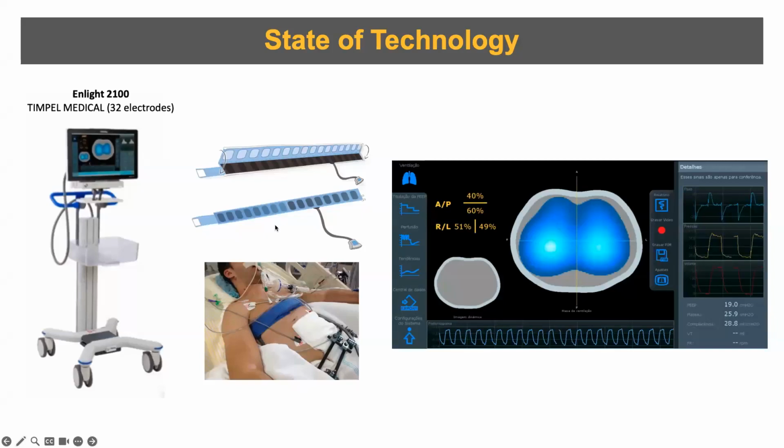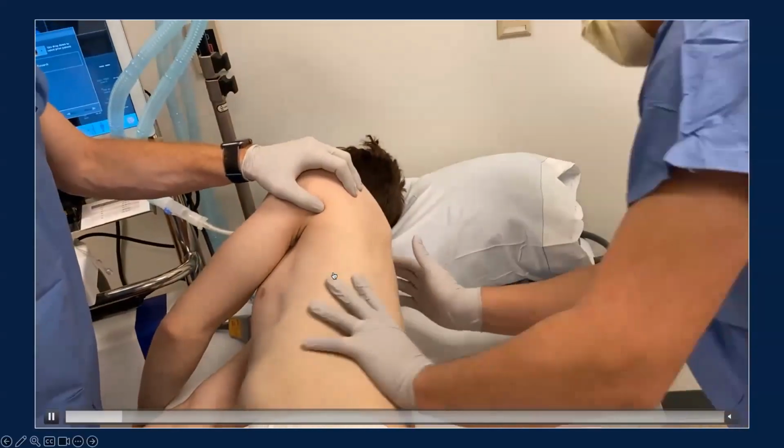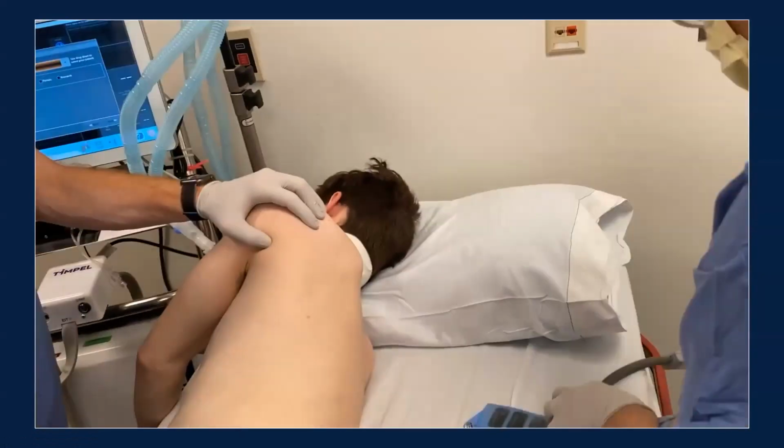And this is the device that we use in our ICU, commercialized by Timpel Medical. And this device was the first approved in the US by the FDA a few years ago. This video illustrates how easy it is to place the electrodes on a patient.